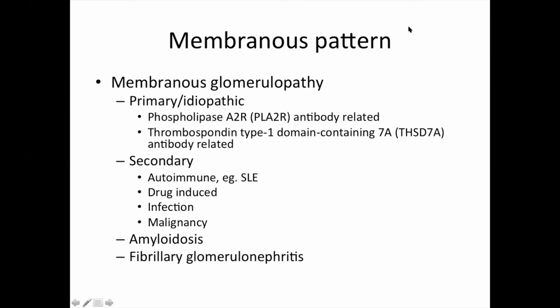So this is a membranous pattern glomerulonephritis or glomerulopathy, and it's either primary or secondary.